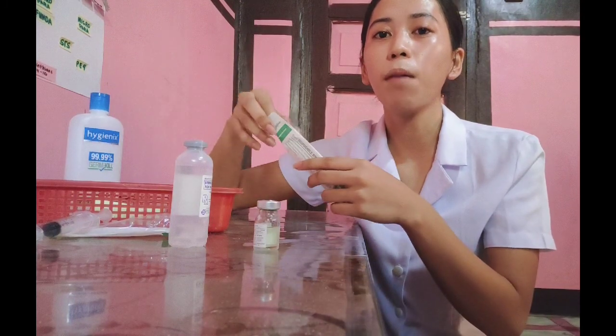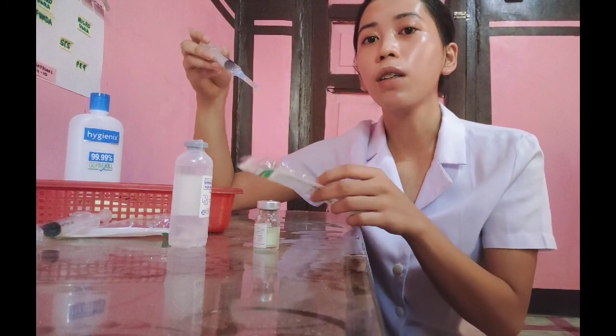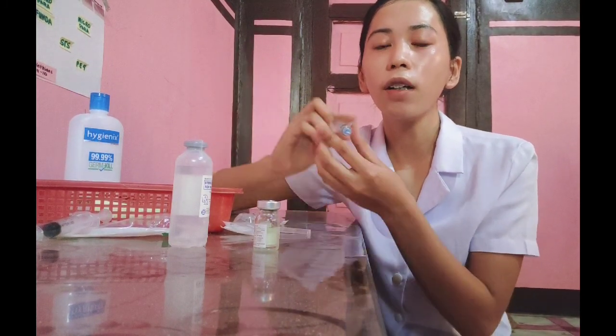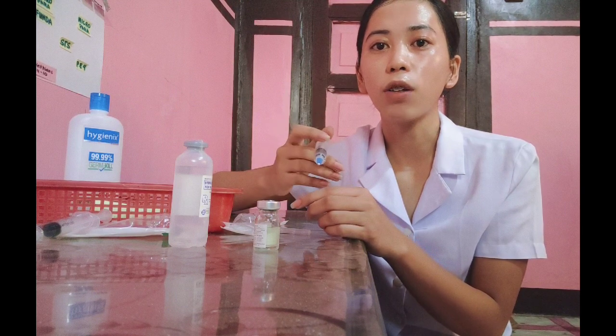Ensure that the needle is firmly attached to the syringe. Remove the cap of the needle, then draw up into the syringe the amount of air equal to the volume of the medication to be withdrawn.